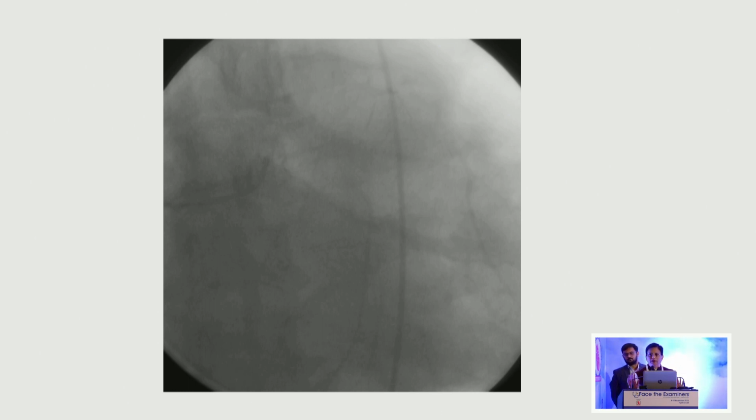No guide went and cannulated. We could not cannulate with any guiding. I tried everything, and by the time, you can imagine, it's a nasty left main dissection, the patient's condition started deteriorating, the patient had hypotension. We had to ventilate him. He was in a very, very bad shape. But still, unfortunately, we were not able to cannulate it with any guide.